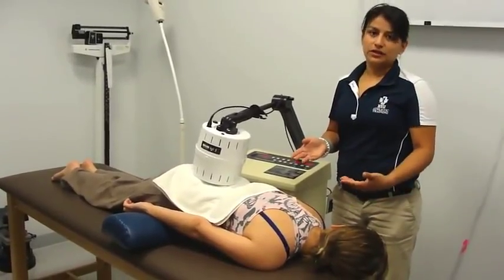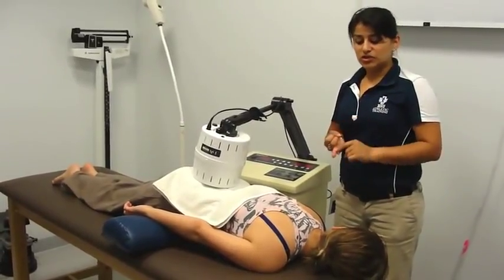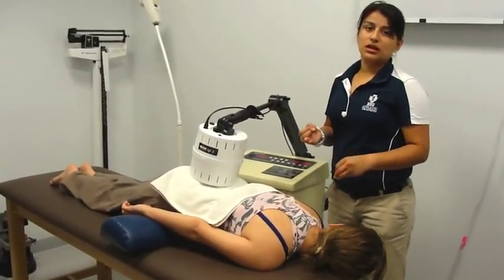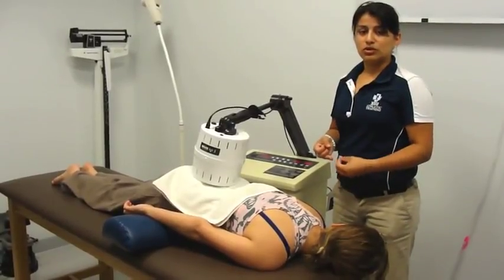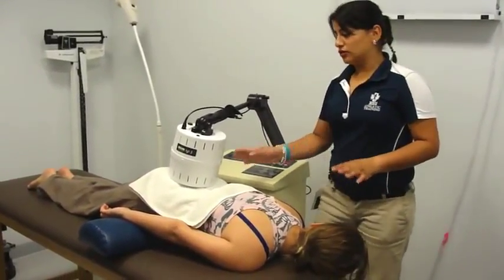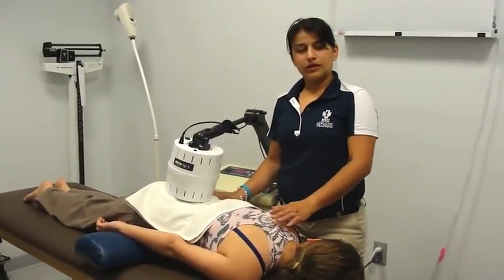Contraindications for this modality: if the person has an open wound, you can't do it. If a person has a pacemaker, you can't do it, or any metal pieces, because that's going to produce hot spots and it can burn the patient. Or if the person has a rash, it will also be a contraindication. It's a very simple modality to use, and it's very good for low back pain and for deep heating of the area. So that will be it.